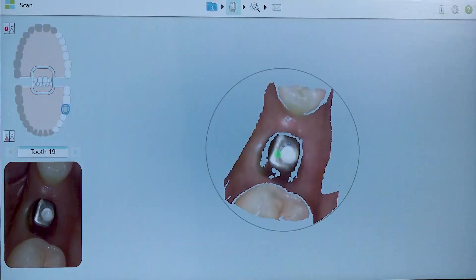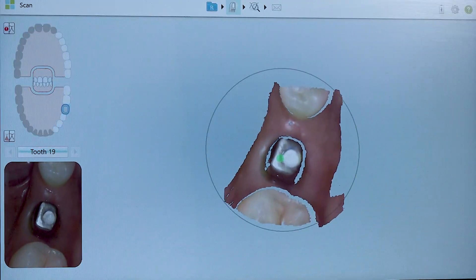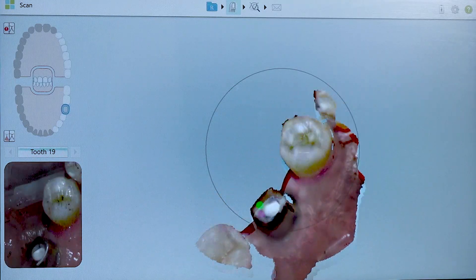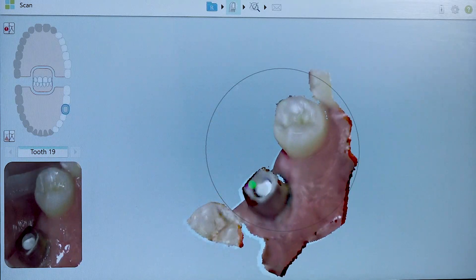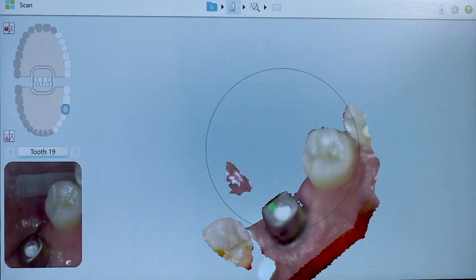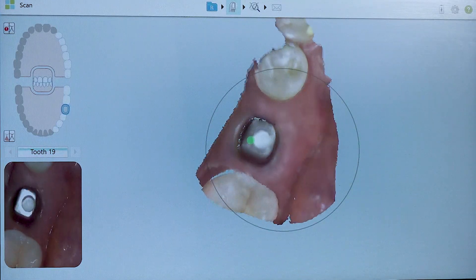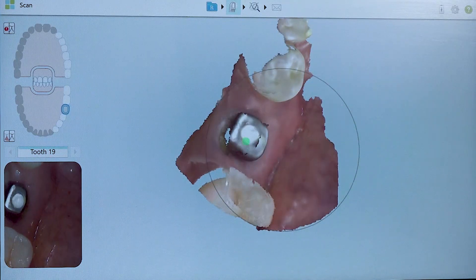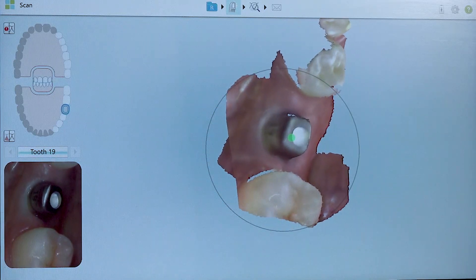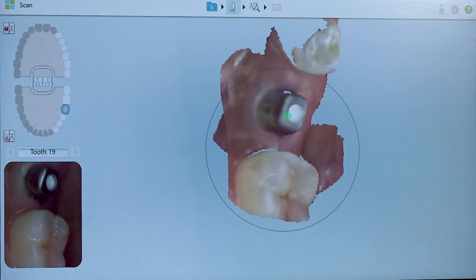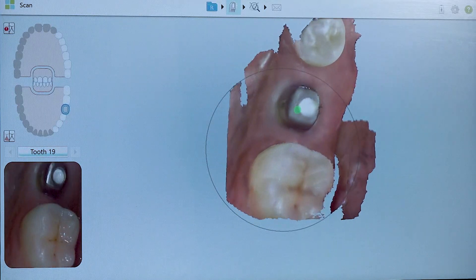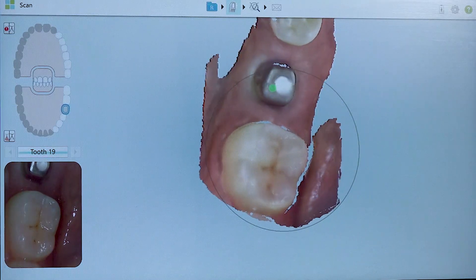Think of it as if you are scanning a preparation for a full coverage crown. If gingival tissue is covering the margin of the abutment, you must retract the tissue exposing the margin. In an ideal situation, the abutment's margin is either equigingival or slightly subgingival for aesthetic reasons. To expose a subgingival margin, cord can be gently placed to retract the tissue during the scan.